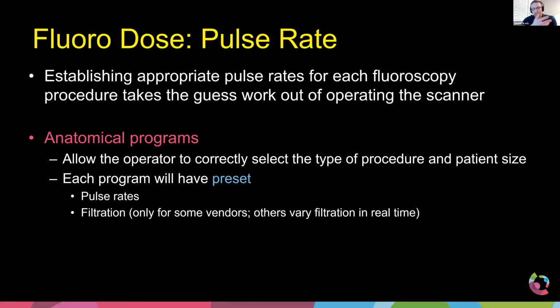Too much filtration, however, can adversely affect contrast because your KV goes up. Higher KV means lower contrast in the body. And higher filtration equals larger focal spots. That means your spatial resolution goes down.